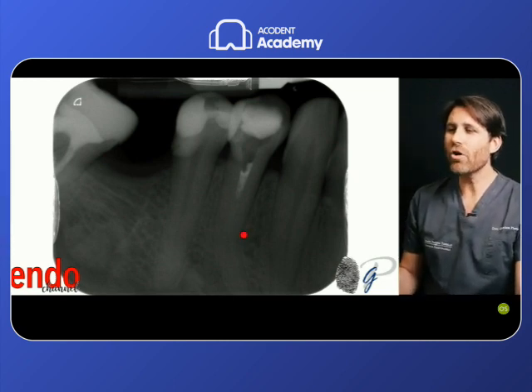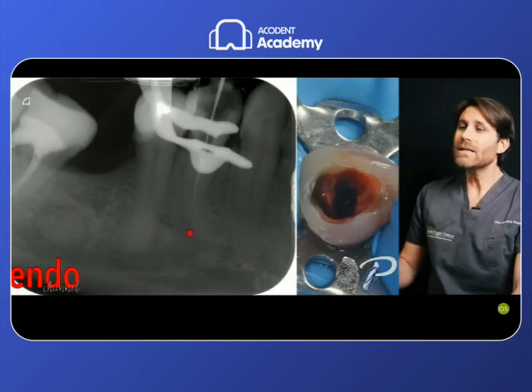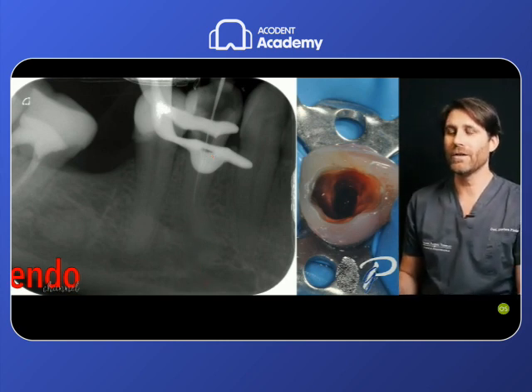When we have a short root canal treatment, usually we can find a calcified portion of the apical third of the root canal. In this case, it was not possible to penetrate by hand file more than this after removal of the filling material because of calcification of the apical third of these canals.